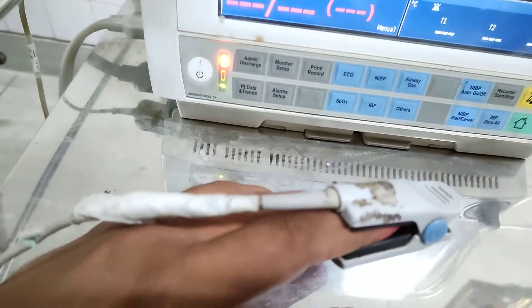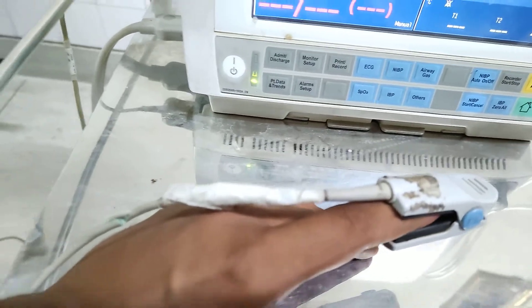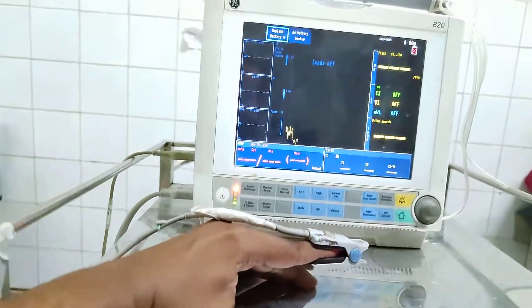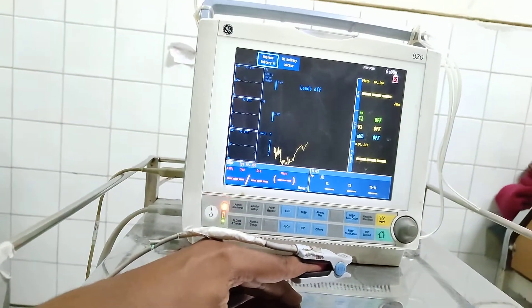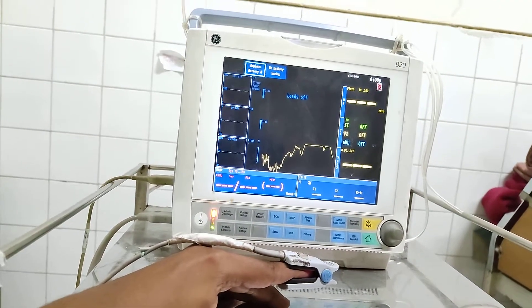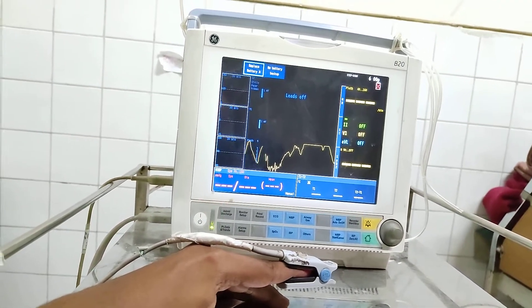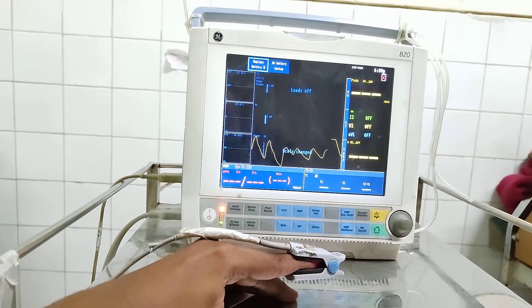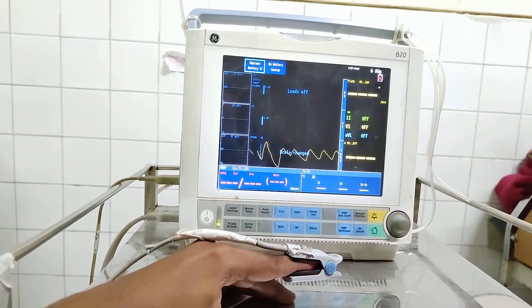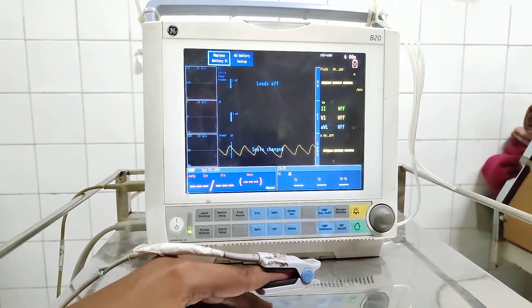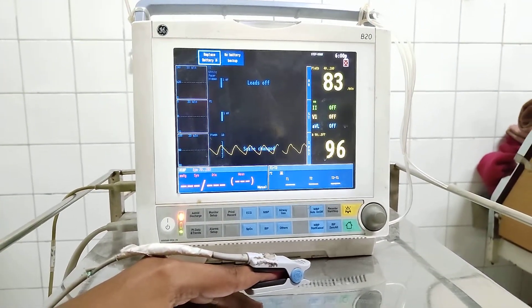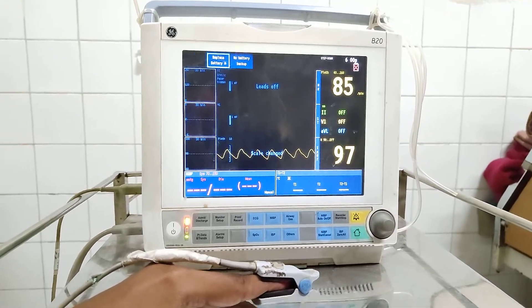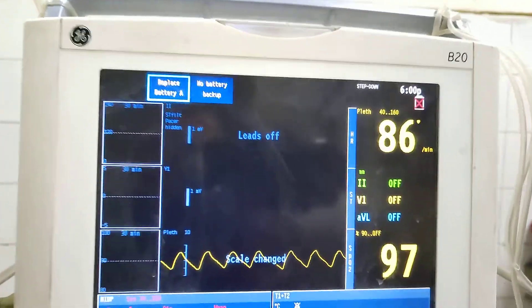We put the patient's blood pressure cuff, so we can check the patient's blood pressure. Let's see the patient's blood pressure — the pulse rate is 86.